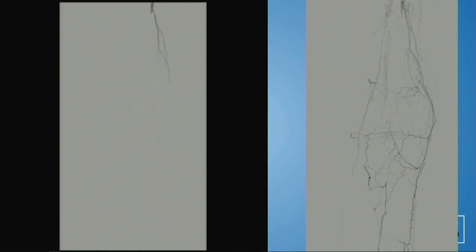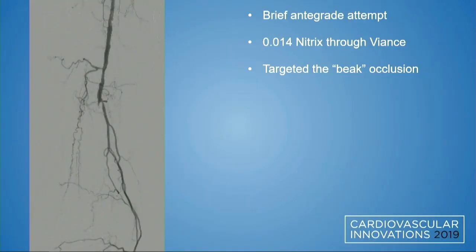And the question with regards to what reconstitutes, whether that's distal popliteal, that's tiny, whether that's small vessel arching out, almost retroflexed, but at a 90-degree angle at best, whether that was the AT versus a collateral, and if that's our TP trunk extending down into that peroneal with an occluded posterior tibial at the ostia.